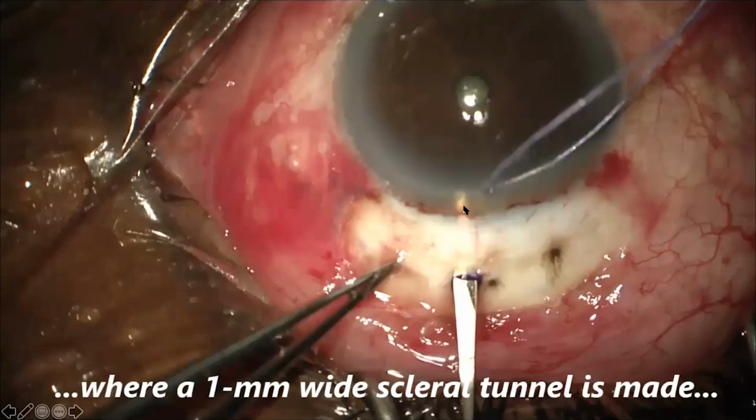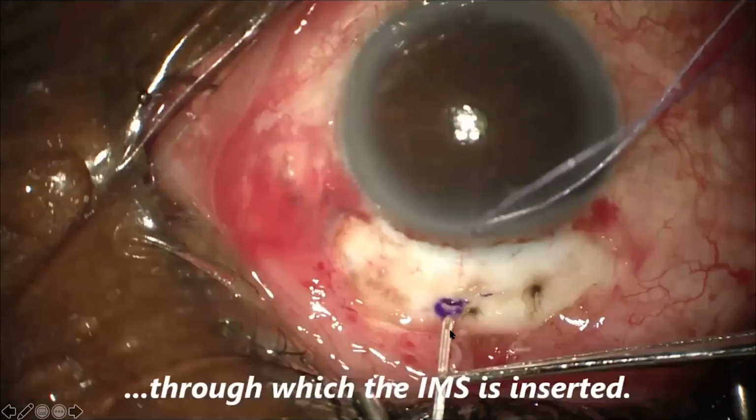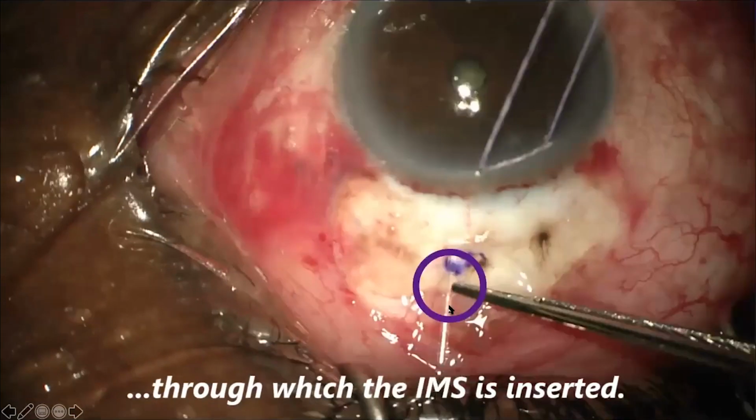This is what you want to see. You want to see the proximal end of the blade get into the anterior chamber, and this wider portion just makes this pocket here in the sclera. After that's done, you're going to insert the device bevel up into the track, and this is what you should see. The more proximal end should be coming into the anterior chamber here, and here are your fins. Again, this purple circle, these fins are going to slide into the pocket here. It's going to keep the device from migrating, and it's going to prevent any peritubular flow.